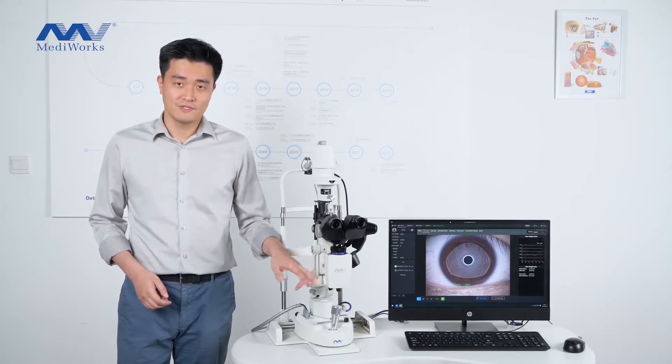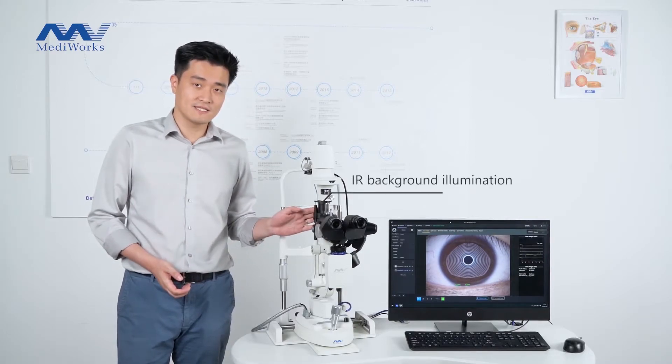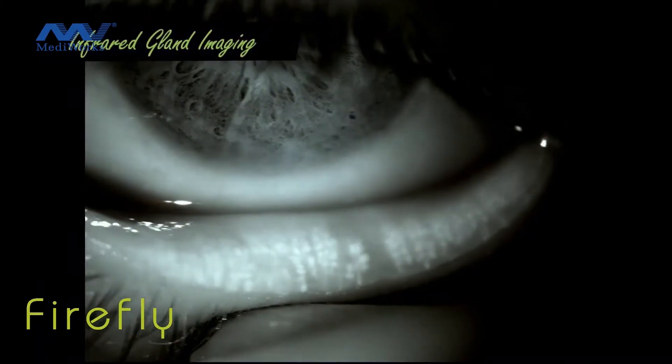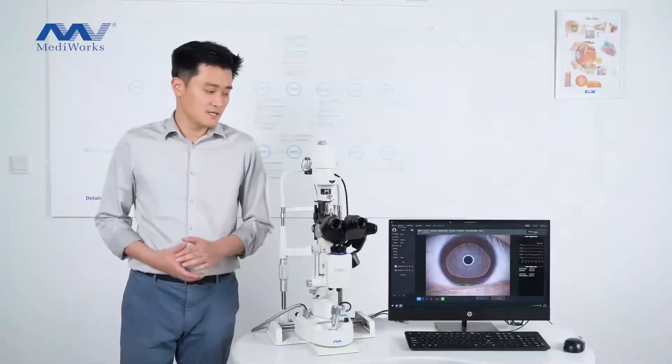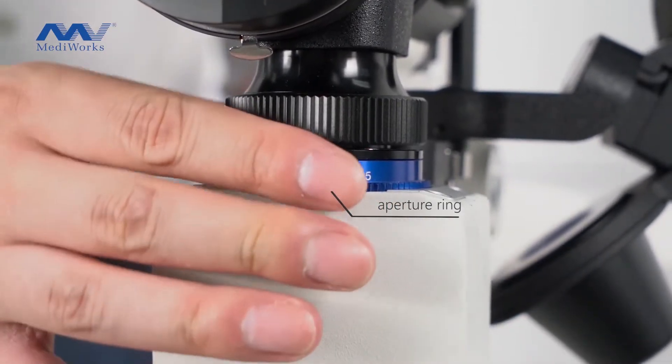Inside the module, there is an infrared receiver. Cooperating with the infrared background light, it can take images and videos for the Meibomian glands. The depth of field can be adjusted by the aperture ring.